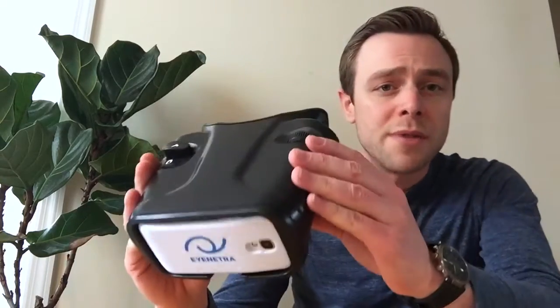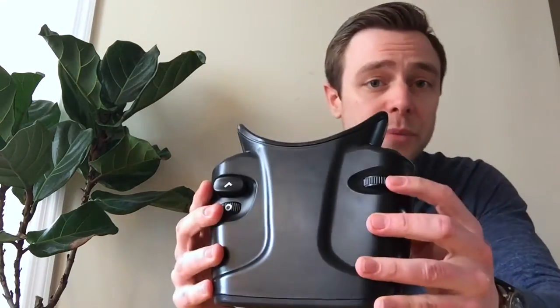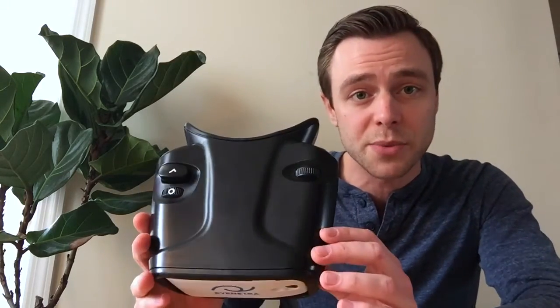Hello everyone, Greg here from iNetra. Today we are going to speak about instructions for use of the iNetra autorefractor. The iNetra autorefractor is a smartphone powered self-test device that combines subjective input from the patient with the computational power of the smartphone to screen patients for nearsightedness, farsightedness, axis of astigmatism, and measures for PD or pupillary distance as well.